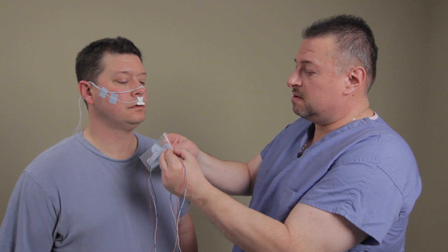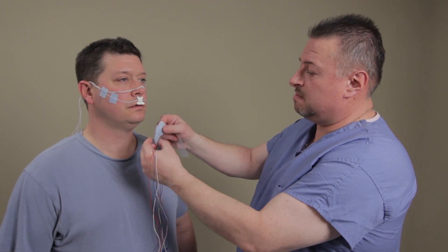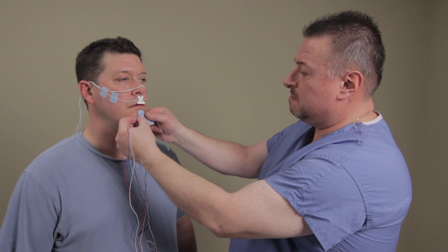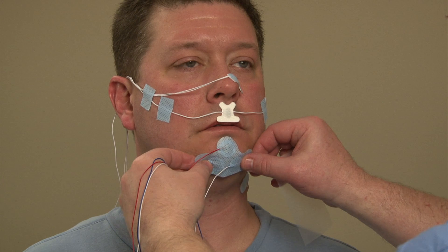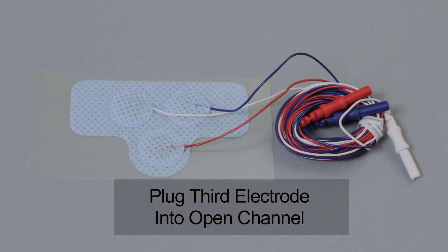Peel the electrode patch from the card and place on the chin. Plug the redundant third electrode into an open channel. If good impedance is lost on one electrode during the night, the third electrode can be used without waking the patient.